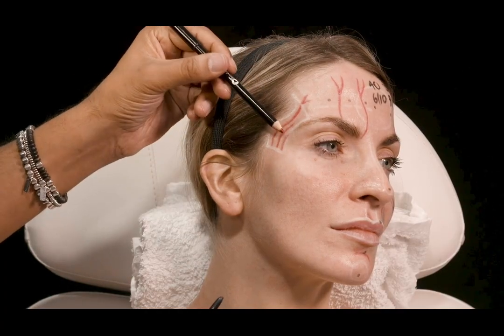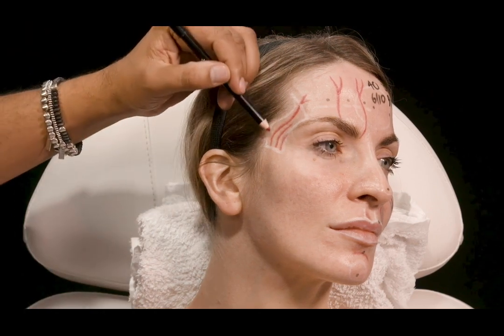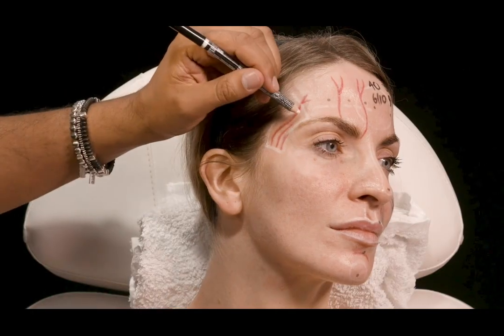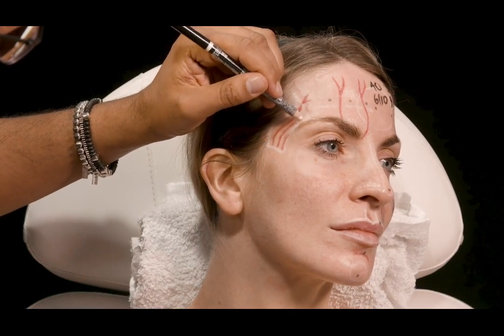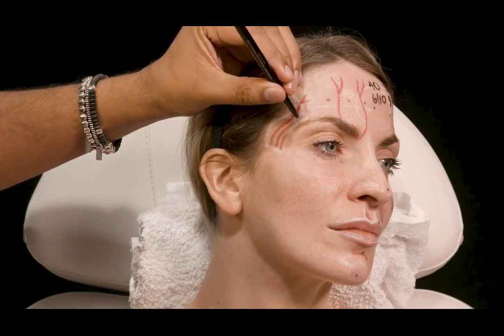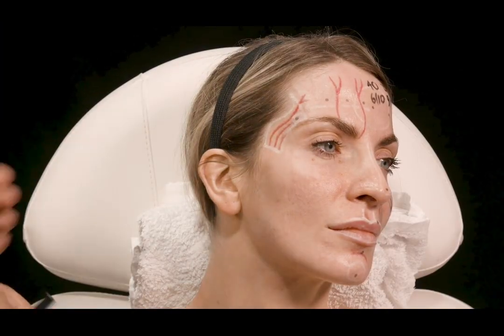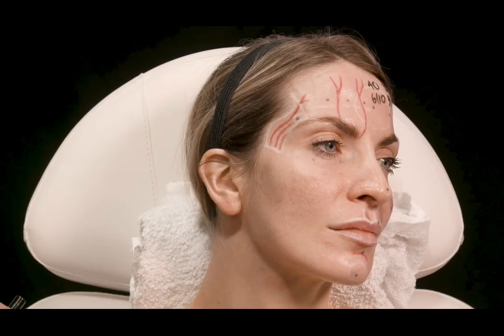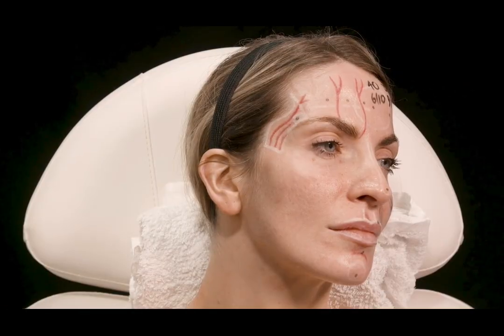Now, these 2 vessels run in the temporalis muscle. This one is running in the subcutaneous tissue. What it means is that in this superior medial quadrant of the temporal fossa, you have complete safety right here on the bone with a needle. If you go superficial here, you may catch the frontal branch of the superficial temporal artery. If you go too far down, you may catch the deep temporal arteries, so just stay away from that.